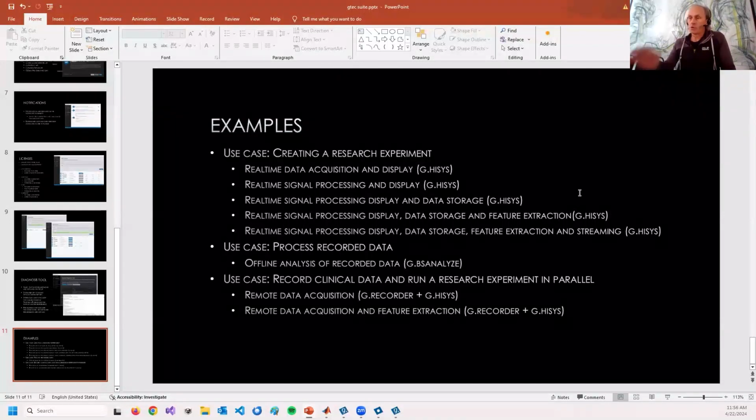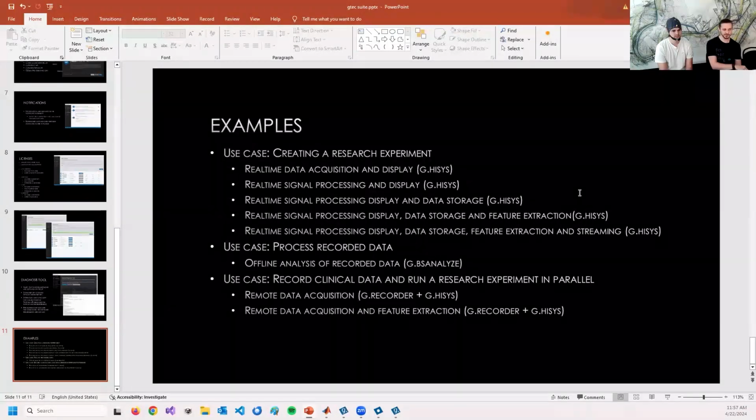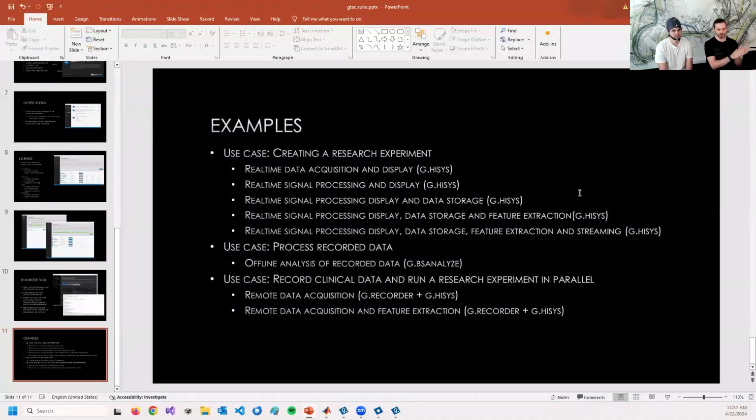And Ali is asking, when you're using a higher cutoff frequency of 30 Hertz, why is it still necessary to use a 50 Hertz notch filter? The low pass filter is not perfectly steep, so it's just dampening, and the 50 Hertz are that big that you can still see it in some cases. So you can go for higher filter orders, but then you would at some point get unstable filters or filter swinging, or you additionally add another 50 Hertz notch. With dry electrodes, you sometimes even see the 100 Hertz and multiple frequencies still when applying a low pass filter.